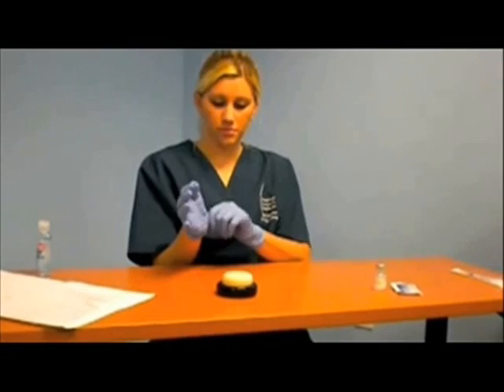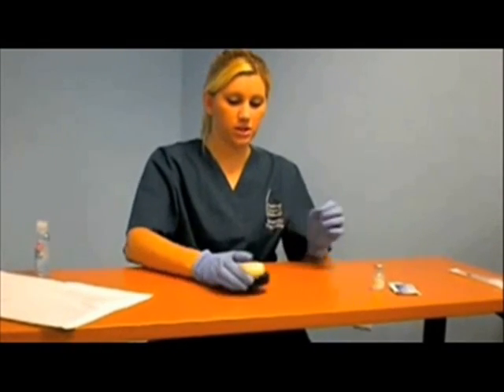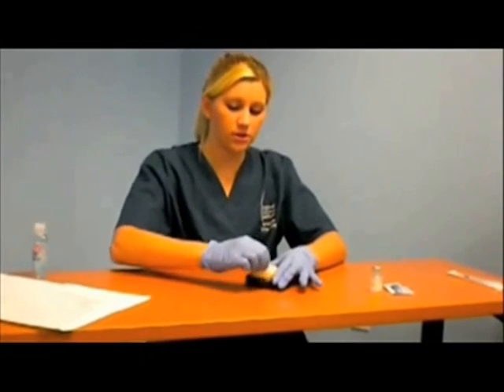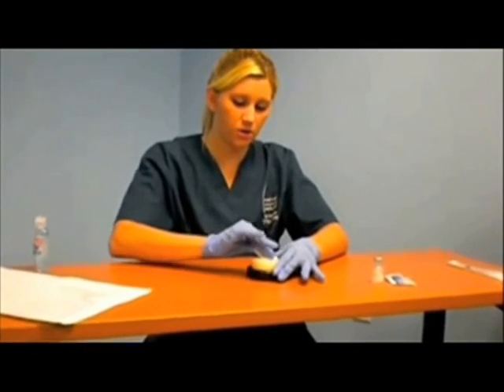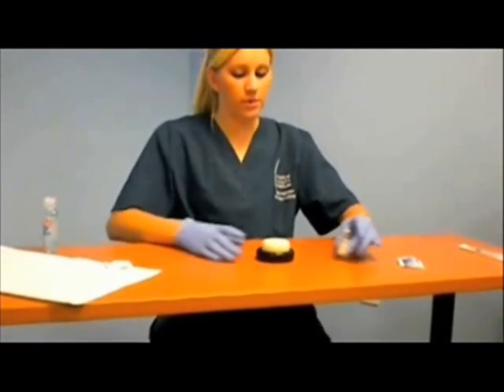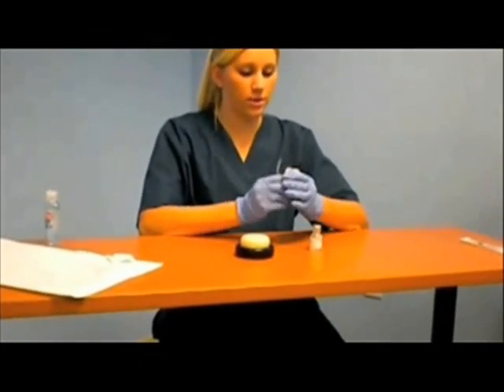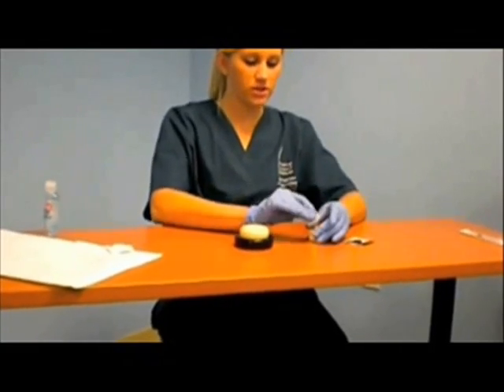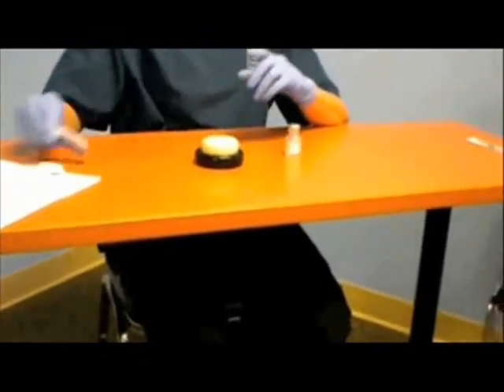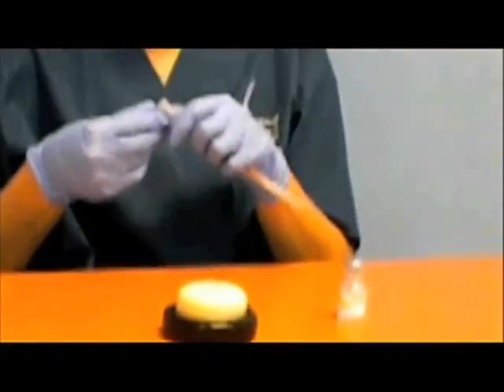Once the gloves are on, clean your patient's site where they're going to get their injection. You do this by rubbing the alcohol pad in a circular motion. And with your medication vial, you're also going to wipe it down with the alcohol pad to make sure that it's clean. I'm going to open my tuberculin syringe.